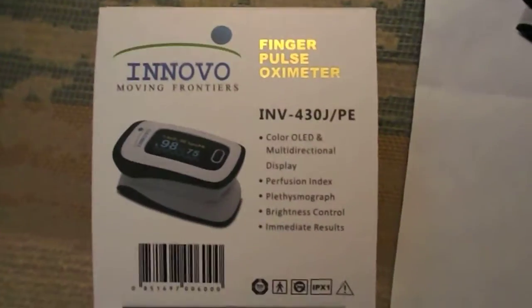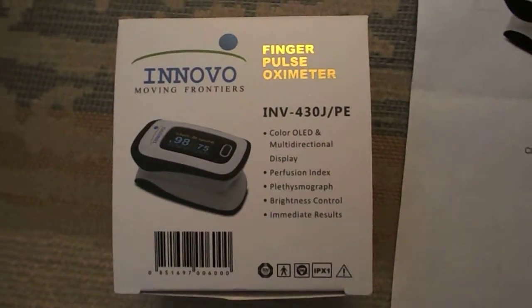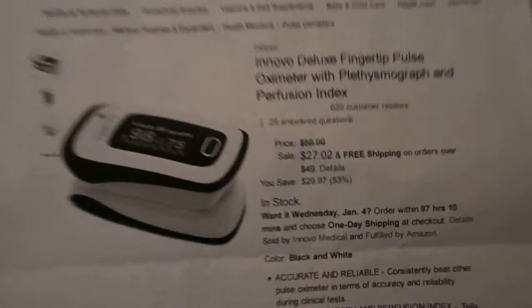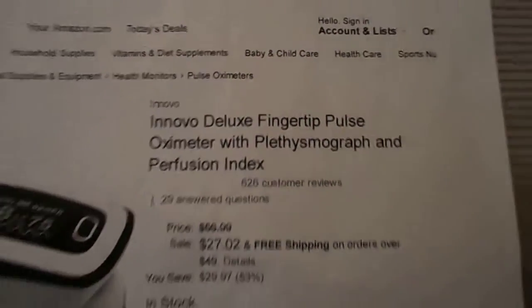Again, this device is the Enovel Finger Pulse Oximeter. This is the box that it came in from the manufacturer. This is how the listing appears on Amazon.com, and it is also available from Walmart.com.